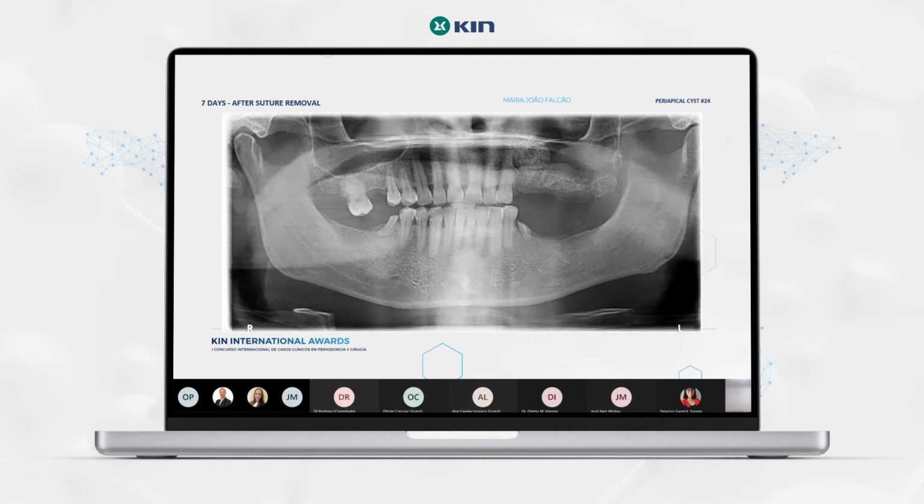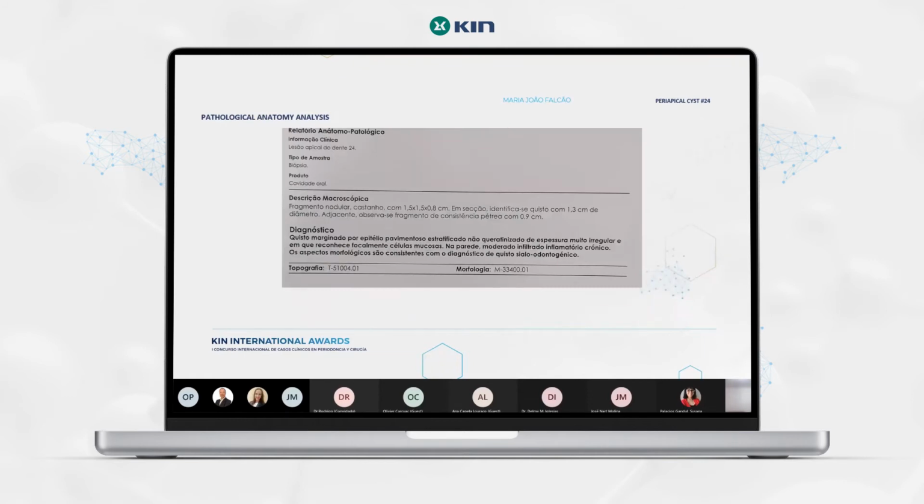And after that, and after we wait for the healing, we will do the rehabilitation with implants. The patient doesn't want removable prostheses. He doesn't use one now. And well, that will be the future. And we probably will need to do a sinus lift to have space to put the implants in the posterior maxilla.